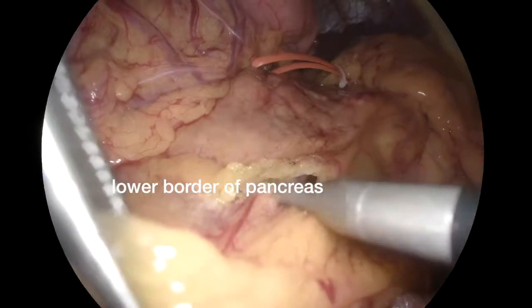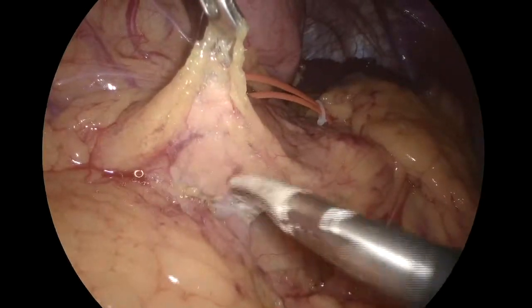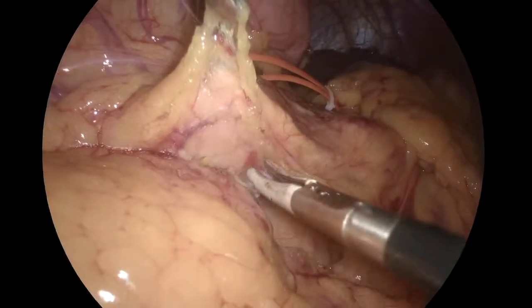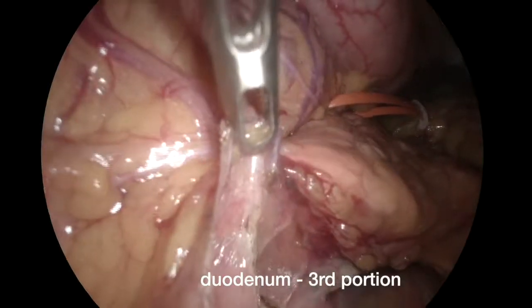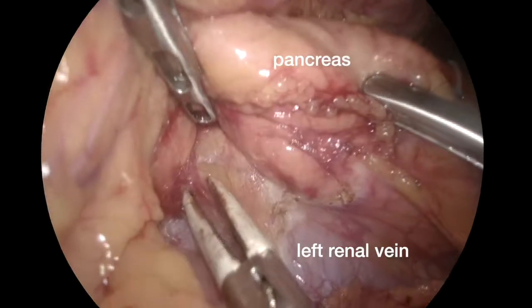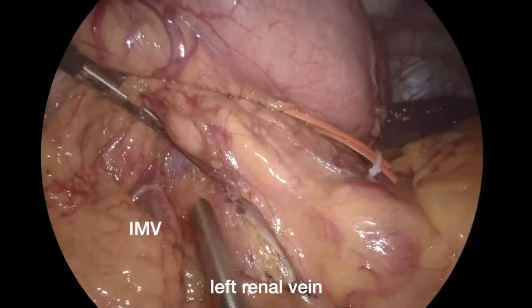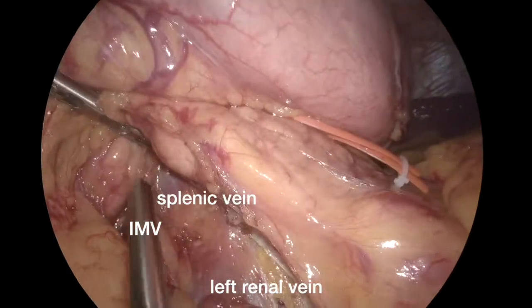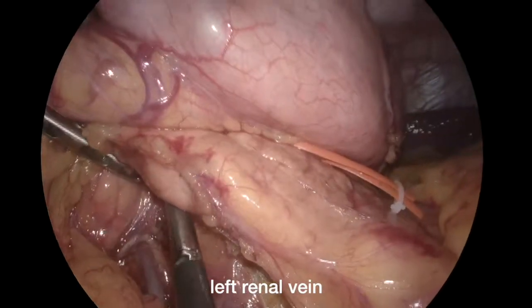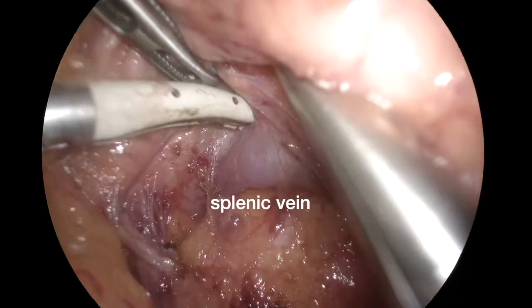The peritoneum was dissected to get into the posterior of the pancreas, to control the splenic vein, and also defining the dissecting plane of anterior RAMPS. The splenic vein was seen here. Then we would want to get as close to the superior mesenteric vein as possible to obtain a good resection margin.